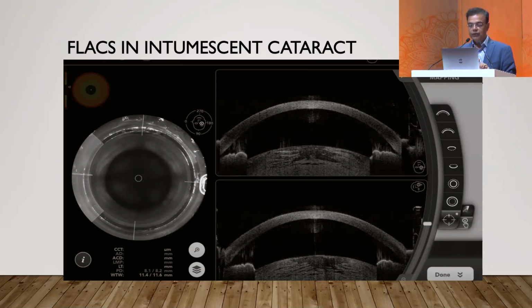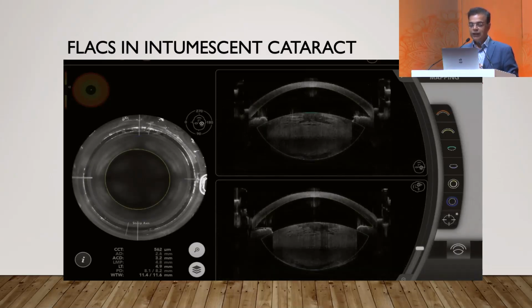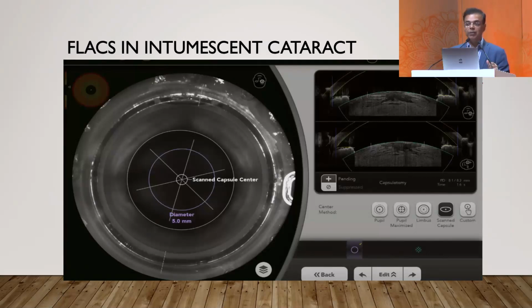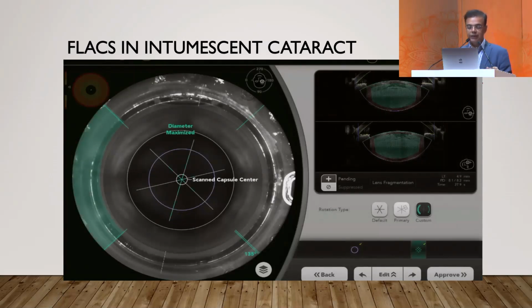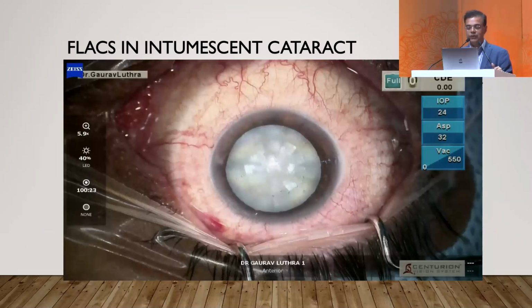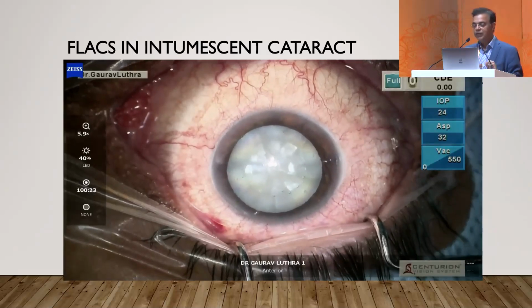Of course, even for laser cataract surgery, there are challenges when you are dealing with these intumescent cataracts. You may not get a complete, perfect rhexis on these patients because the moment there is decompression, as you can see, there was that sudden burst when the lenticular pressure was released. As soon as that happens, sometimes the lens thickness goes down, and some of that fluid from the lens will come out into the anterior chamber, and the plane of the capsule will change. So once you do this, you must stain it with trypan blue.